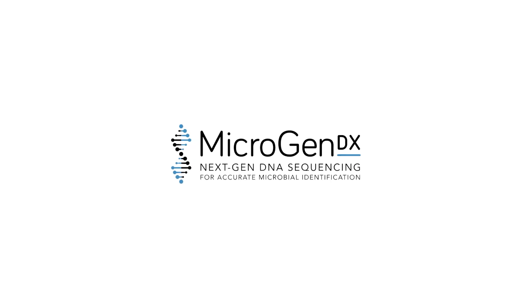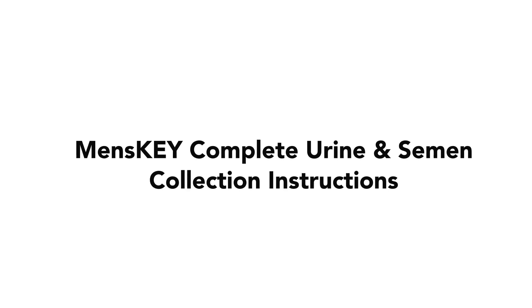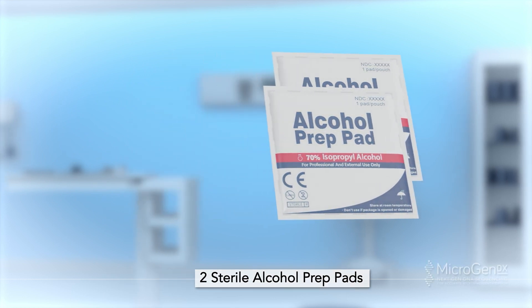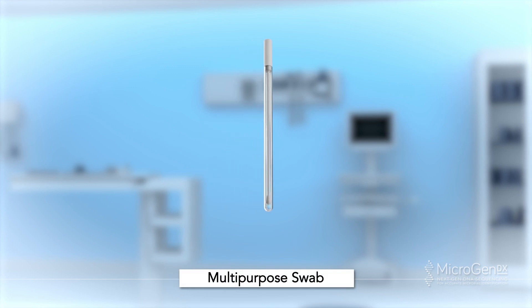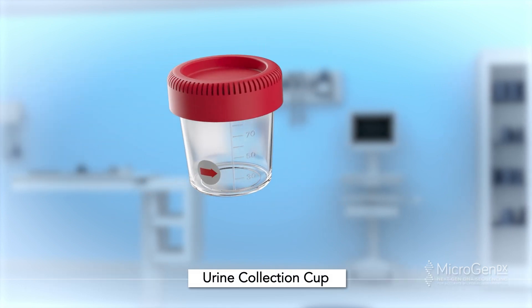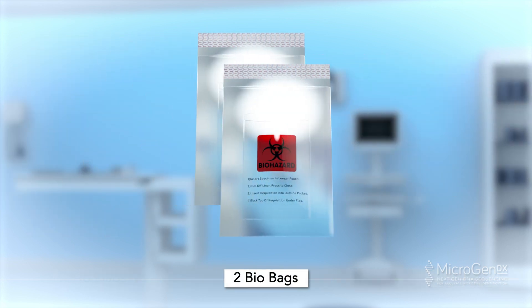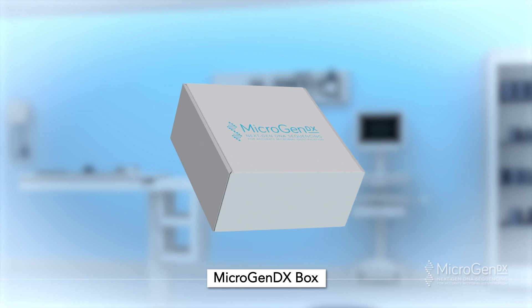MicroGenDX Collection Instructions: Men's Key Complete Urine and Semen Collection Instructions. The MicroGenDX Collection Kit will include: 2 Sterile Alcohol Prep Pads, 1 90ml Cup, 1 Multipurpose Swab, 1 90ml Collection Cup, 2 Bio Bags, 2 Lab Requisitions, and a MicroGenDX Box.